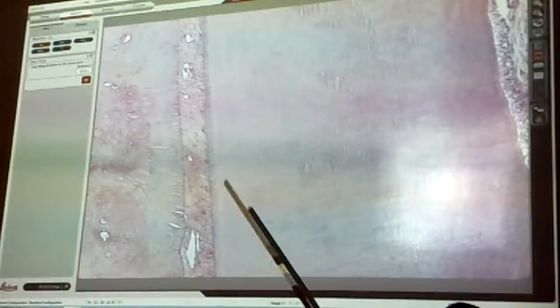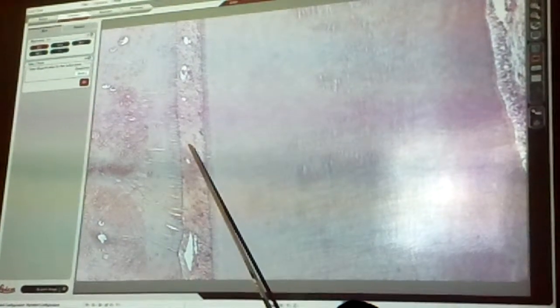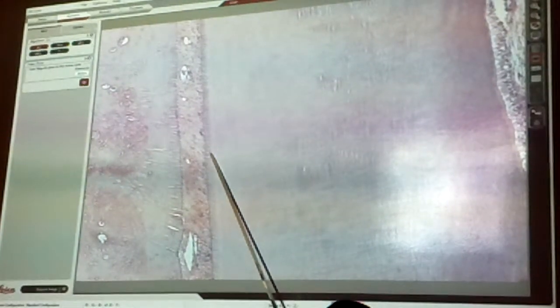So it could be like that. You just got to be careful about what your left and right are. It probably would not be this magnified, simply because then you lose sight of what this is in a way. So again, alveolar bone, periodontal ligament, and the cementum on the edge.